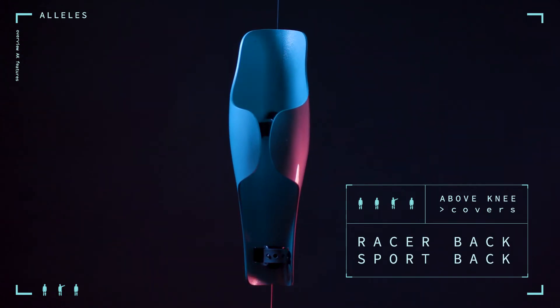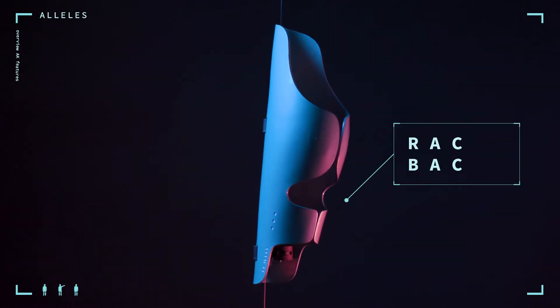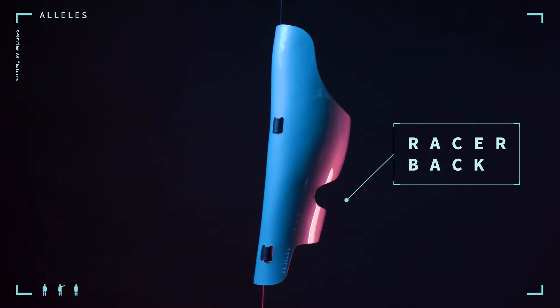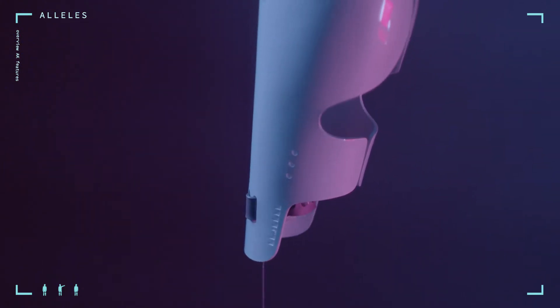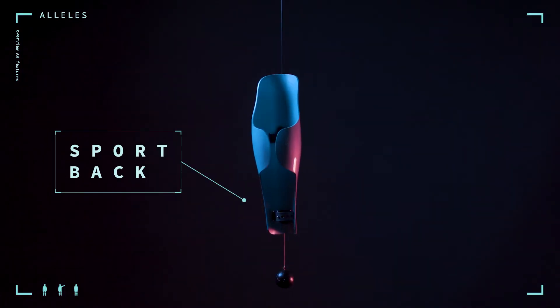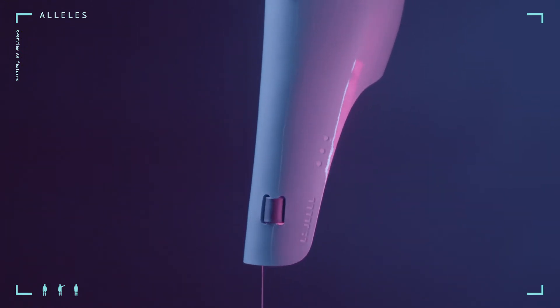Racerback and Sportback for AK. There are two back shape options for the Allel's AK covers: racerback and sportback. Though the racerback has more coverage, neither back shape is fully enclosed down to the ankle. These shapes were strategically created not to interfere with the foot components, therefore allowing us to offer our covers to a wider range of clients. If we were to fully enclose the ankle it creates excess bulk and causes the cover to lose its anatomical shape. The racerback has ankle tabs for a more complete silhouette, while the sportback features an open ankle which allows for larger, more dynamic foot components.